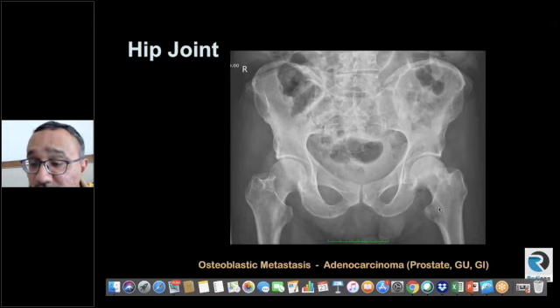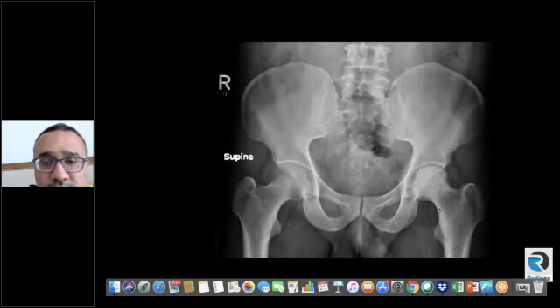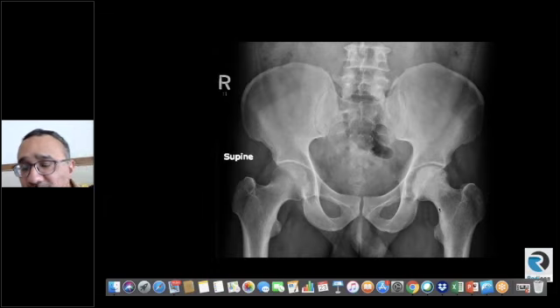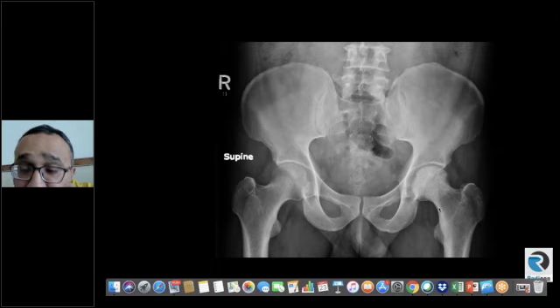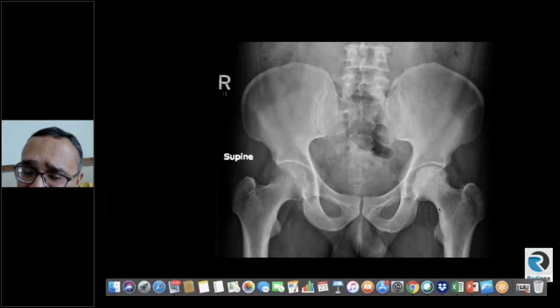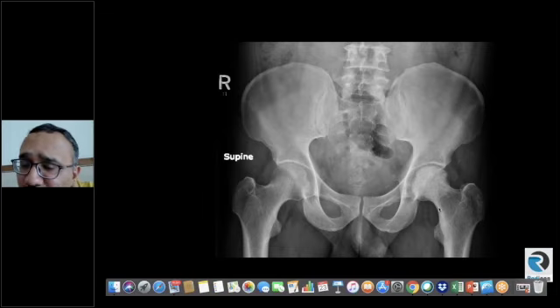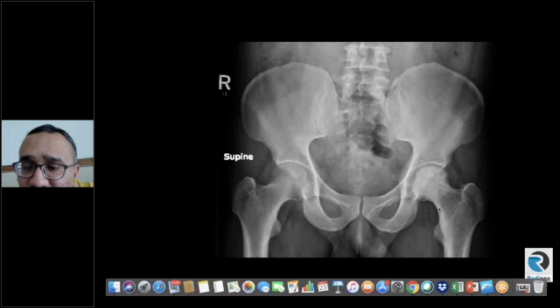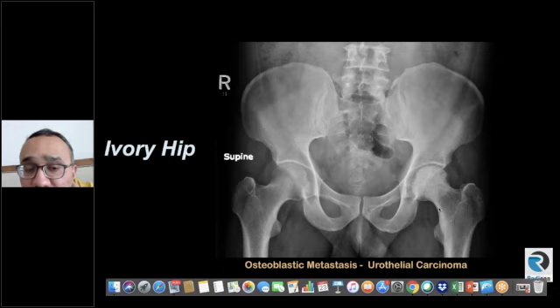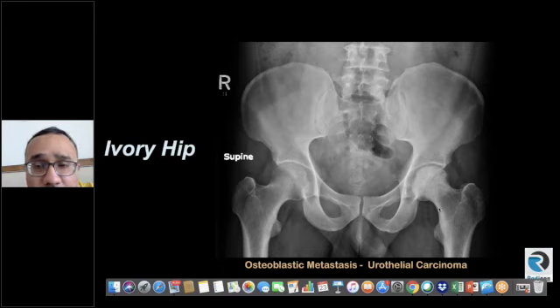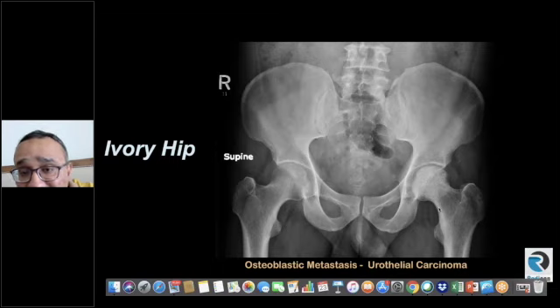Another case — a much younger patient — again showing sclerosis involving the femoral head extending into the adjacent femoral neck. The important point is that the contour of the femoral head is preserved. The sclerosis is disproportionate — it doesn't tally with the normal contour; had it been AVN with that amount of sclerosis, you would expect contour deformity or joint space loss. This was a patient with metastatic urothelial carcinoma. This is the concept of the 'ivory hip' — similar to ivory vertebra or ivory phalanx. The differential includes osteoblastic metastasis and lymphoma.